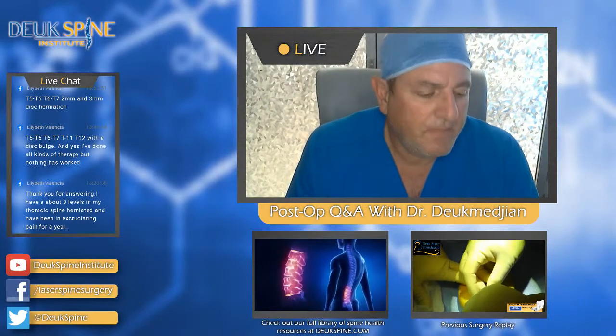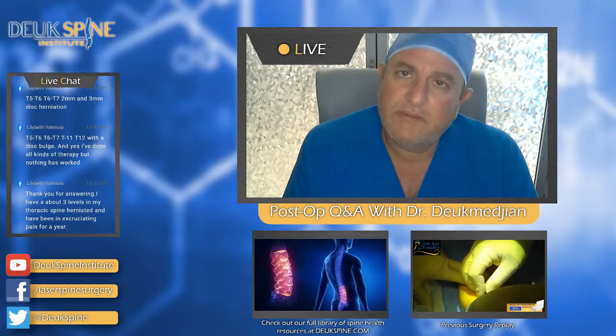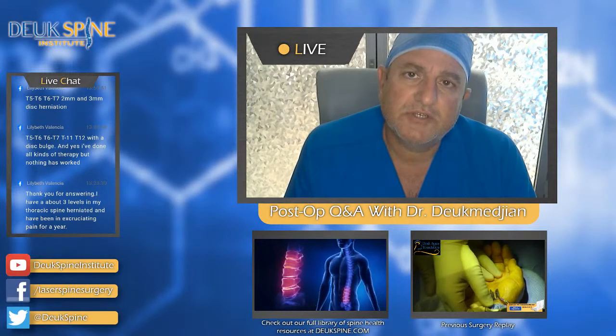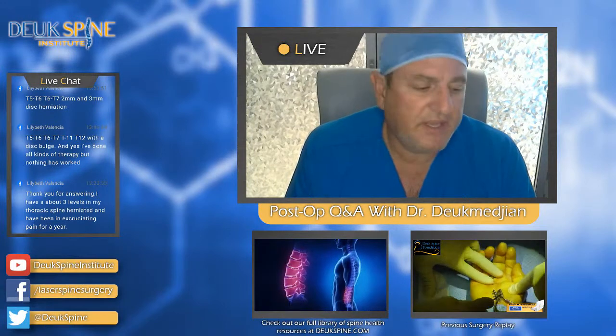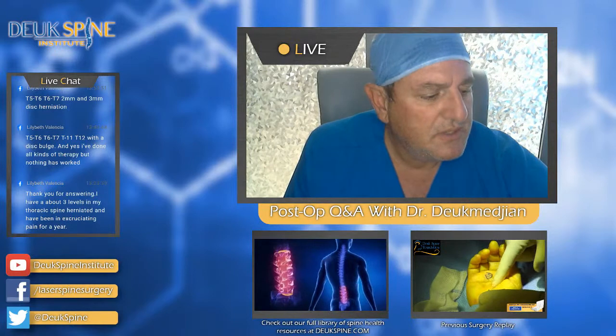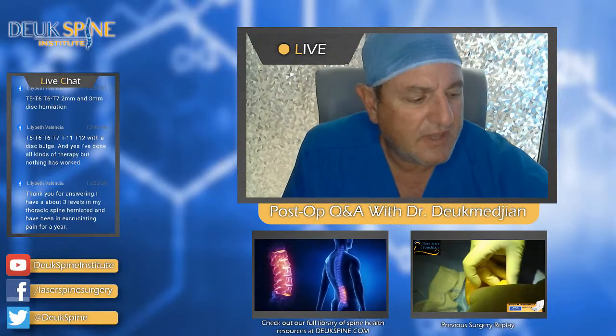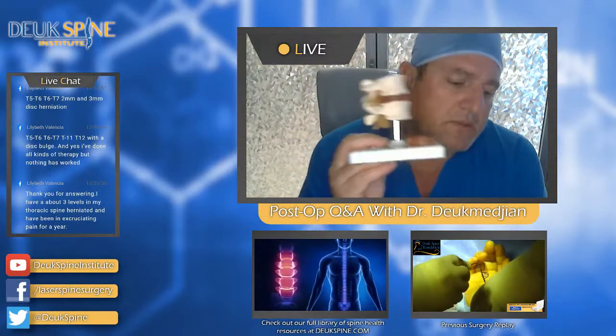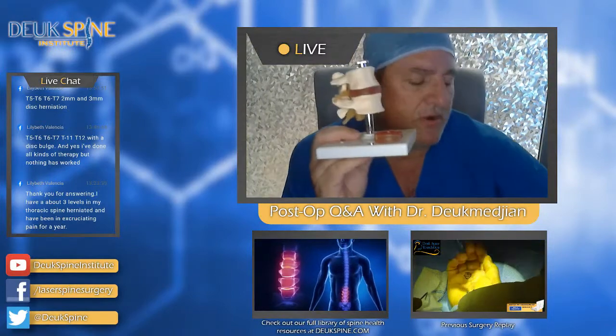He's an engineer. I can't tell you anything more about him except that he's had pain in his thoracic area for about 2 years. And more importantly, the spinal cord was getting crushed by the herniation. It was a big herniation and it was pushing on things from both sides. So just to give you an idea of what I'm talking about, we'll use this little model to illustrate what we did.